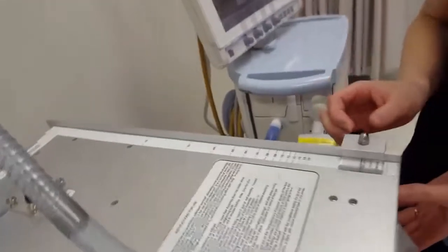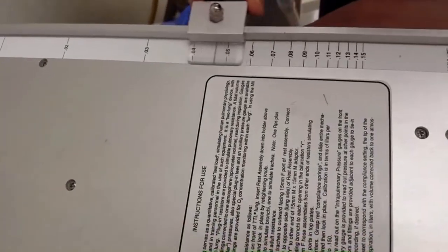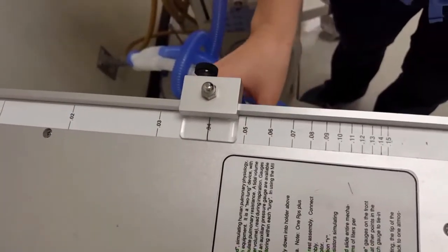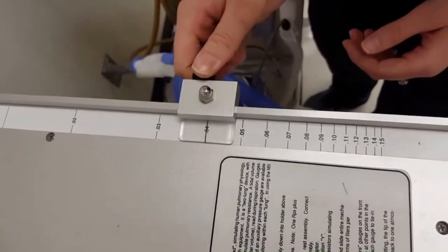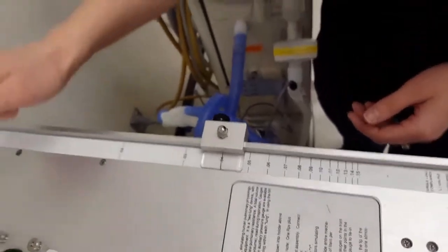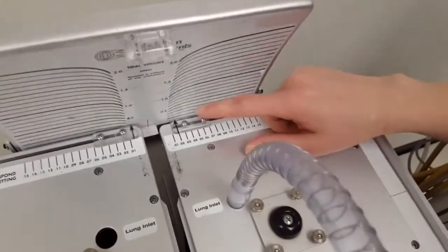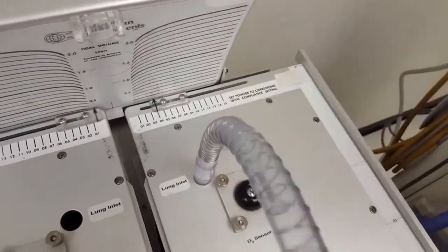If you remember, normal compliance is 40 mils. So we're just going to slide this guy up. And you want to make sure that it's straight up and down, that spring, that it's not crooked. It's just nice and straight. We can twist it on to make sure it doesn't move during the process. And then we're going to adjust our pointer up top to be the same as our compliance. So we're just going to pull it over to 40 as well.